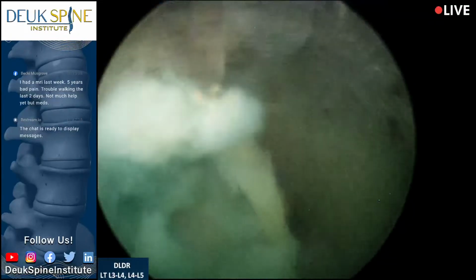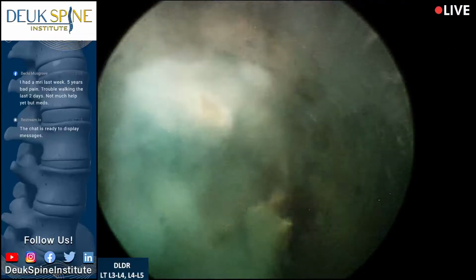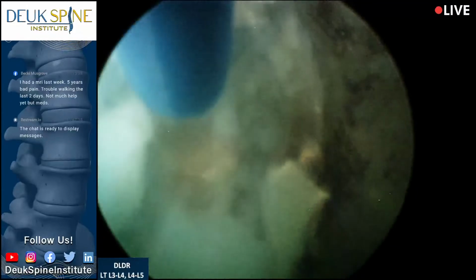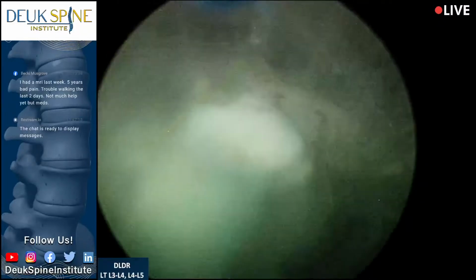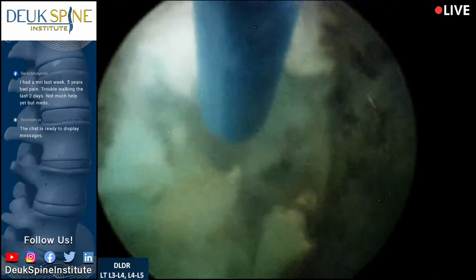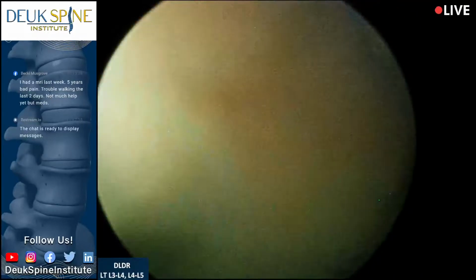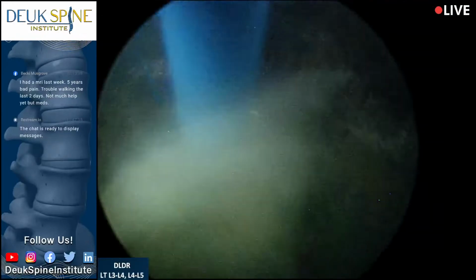It's very slippery and it's scarred down. A lot of people don't realize that the herniated disc is scarred in. Scarred down means it's like super glue all around the pieces, sticking it down there, and we can't get it out with a grabber. It's very slippery and it's stuck down. Everyone thinks, oh, you just need a grabber to go grab it out, but that's not the case.